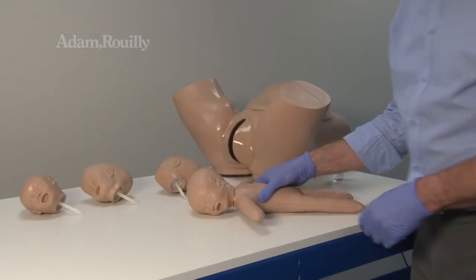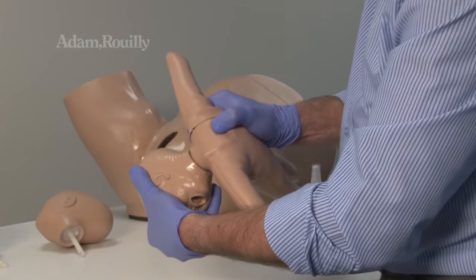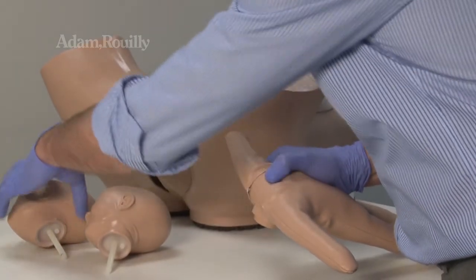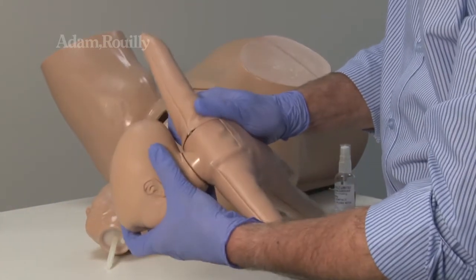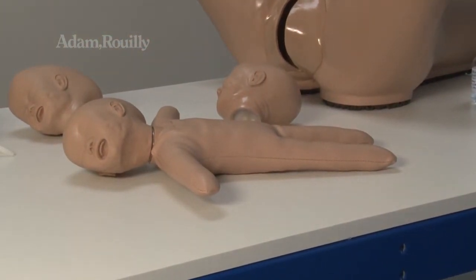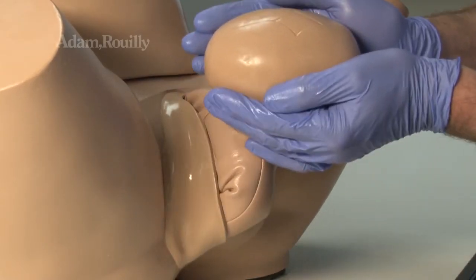To change to a different head presentation, bend the head forward so that the chin rests on the chest and locate the spring catch. Move the catch to the left and remove the head. Insert the rod of the new head into the neck until it clicks into place. Lubricate the new head before use in the obstetric phantom.